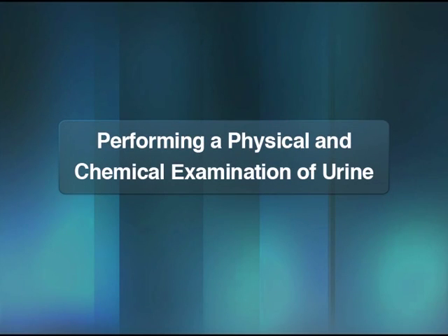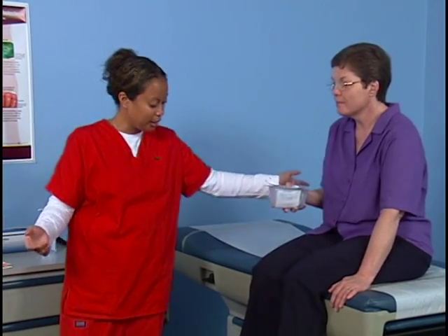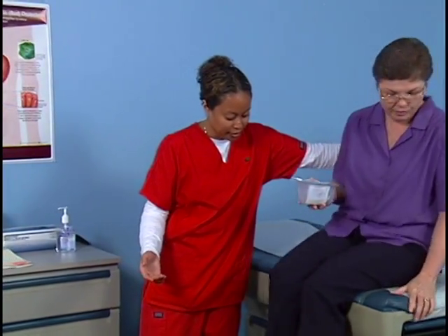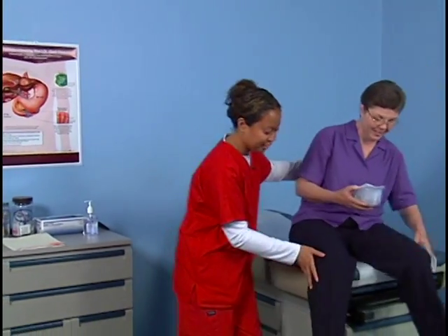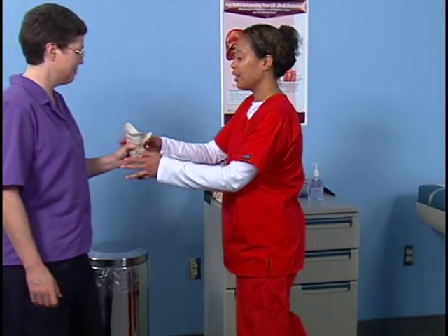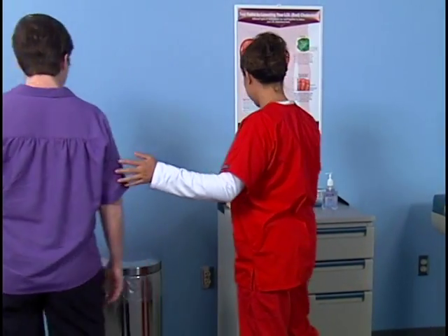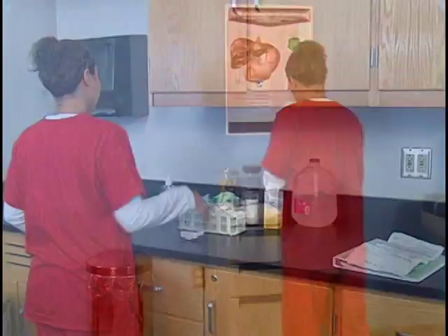The medical assistant will now perform the physical and chemical examination of the urine specimen. Begin by obtaining a freshly voided urine specimen from the patient using a clean container. A first voided morning specimen is preferred for the Multisticks test, but a random specimen is acceptable. The container should be clean because contaminants in the container could affect the test results.